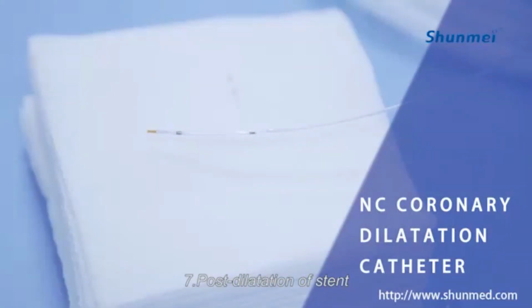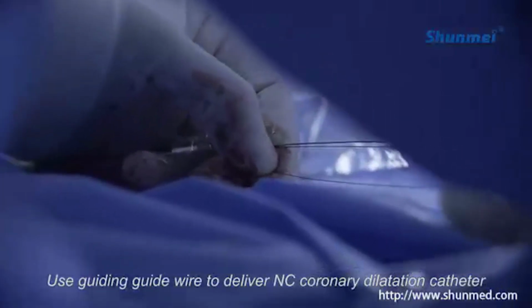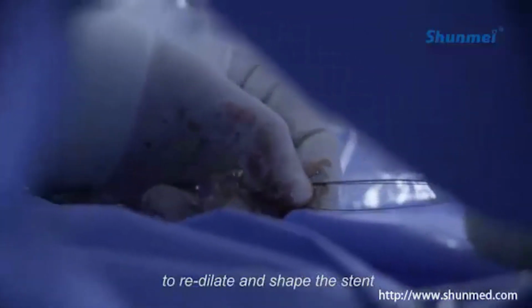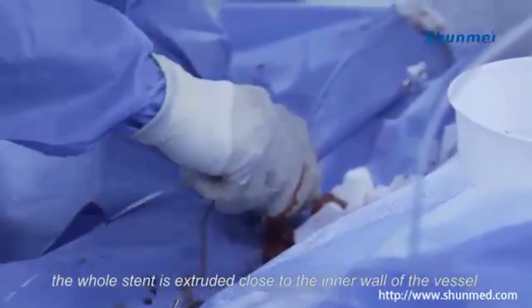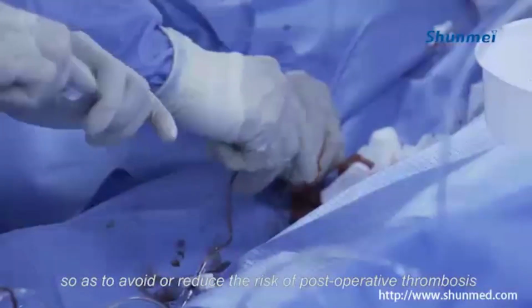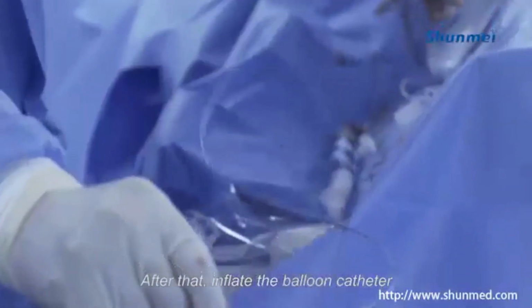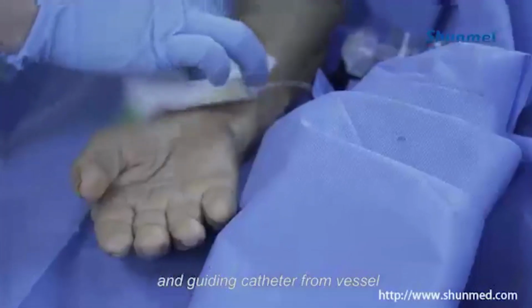7. Post-dilatation of stent. Use the guiding guide wire to deliver an NC coronary dilatation catheter, the post-dilatation catheter, to redilate and shape the stent. After post-dilatation, the whole stent is extruded close to the inner wall of the vessel so as to avoid or reduce the risk of postoperative thrombosis. After that, deflate the balloon catheter and withdraw it together with the guide wire and guiding catheter from the vessel.